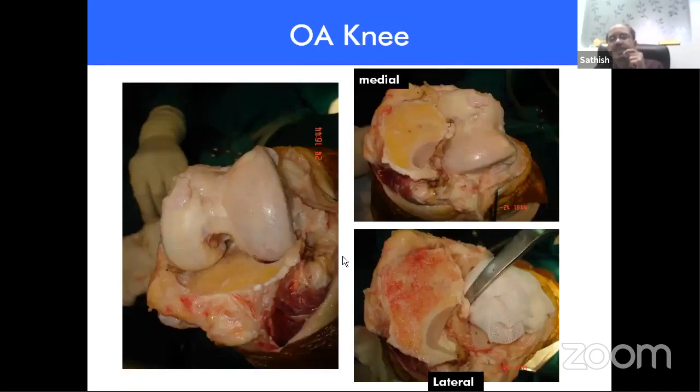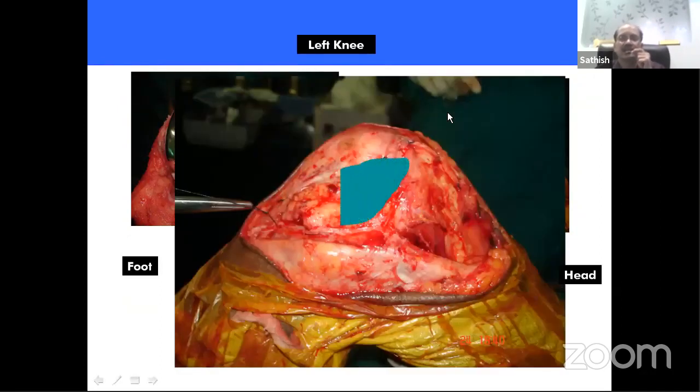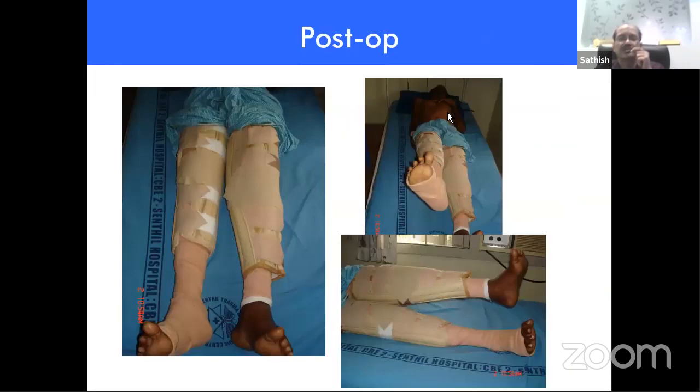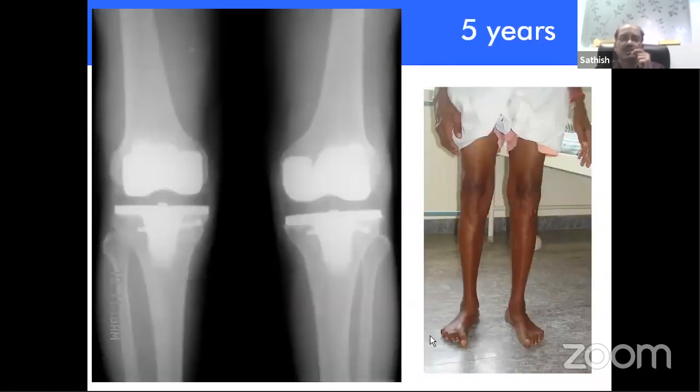So in this particular patient, you can see there is a very clear big posterolateral defect. So bone grafting has been done, and you can see the layer, and it has been closed. And again, that is what we call the expanded area. And the skin can be closed. This is the immediate post-op X-ray. The video is not working. So this is the 5 years post-op. You can see the grafts are incorporated well.